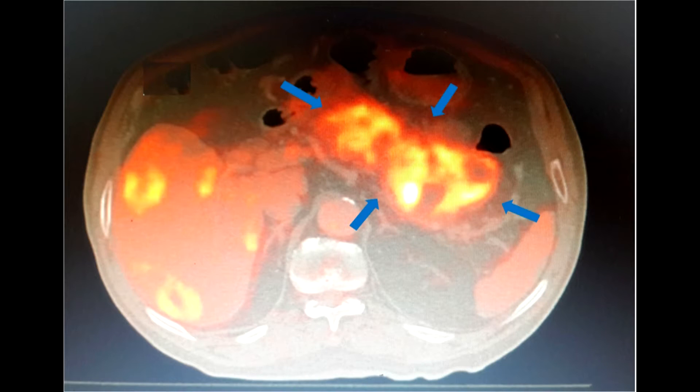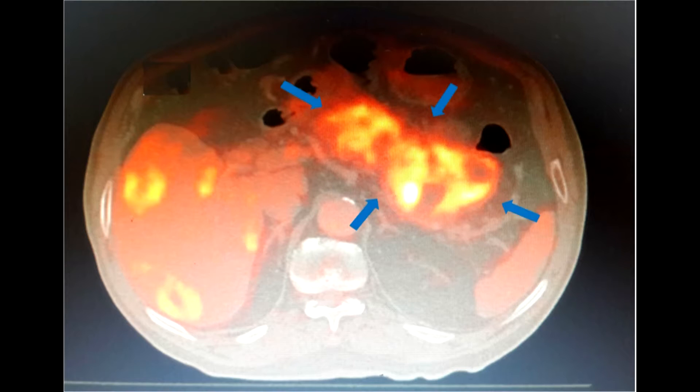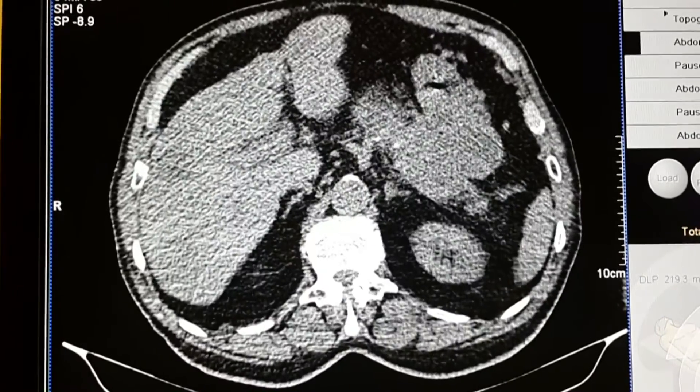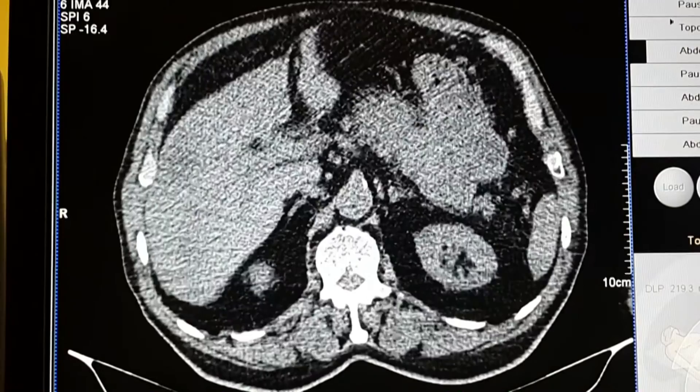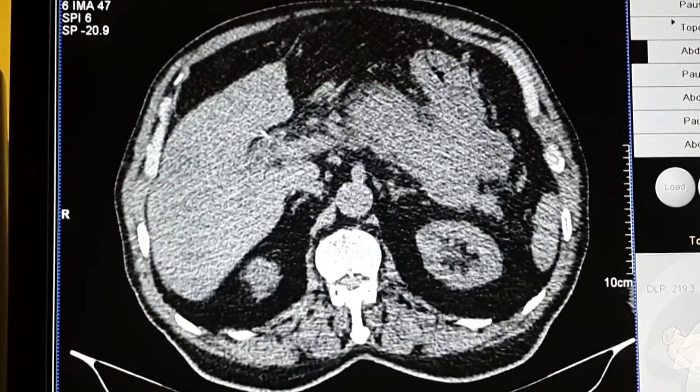Let's see how such a biopsy is performed. Our patient is a 72-year-old male. The PET CT shows a large mass at the junction of the pancreatic body and tail. Our purpose is to put a needle into the mass under CT guidance, then advance a thinner needle through this needle to obtain multiple tissue samples.